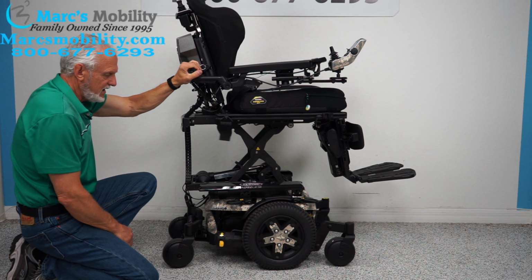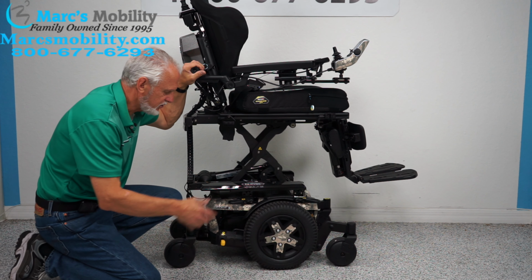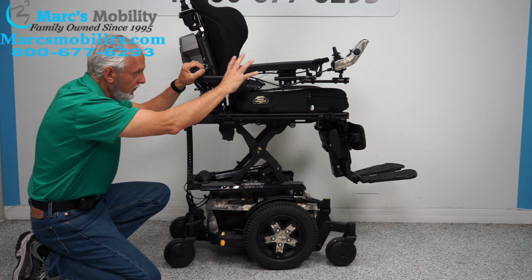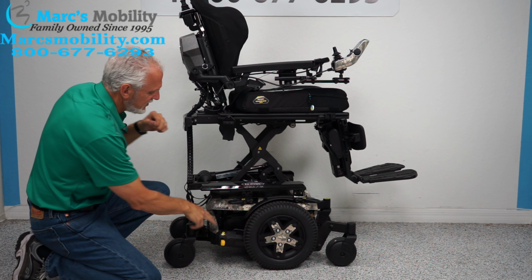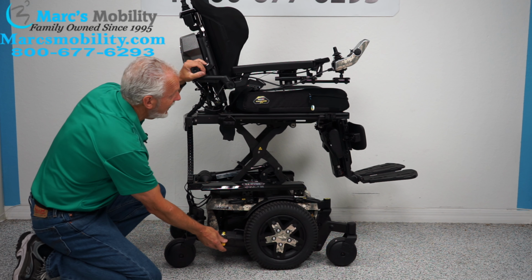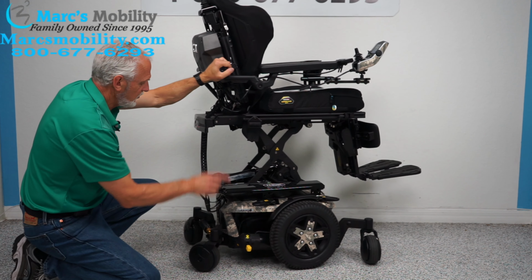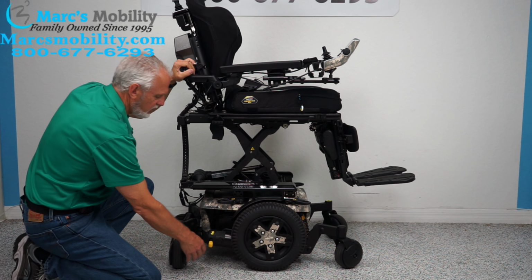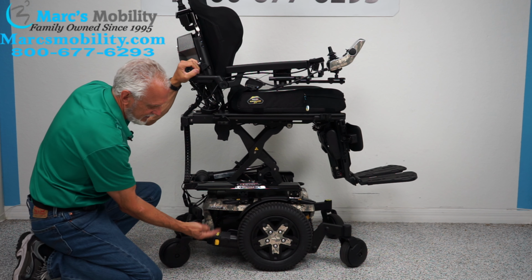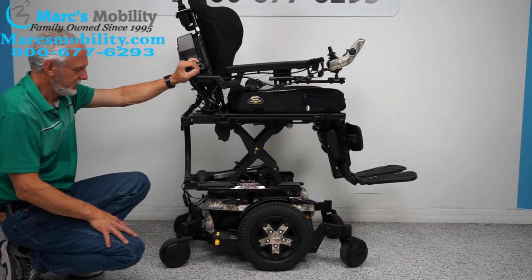Well, right now you can see this chair probably weighs 450 pounds, okay? I'm not gonna be able to lift it or push it. But if I turn the power off, so if you ever had an issue, turn the power off so there's no resistance in the motor. Power is off. Then take this lever right here, push it down, and now you're in neutral. You see how the wheel just freewheels? So you have to do both sides, and you can wheel your chair around, okay? When you're done, do not forget, put it back in gear, and then turn your power back on up there, okay?